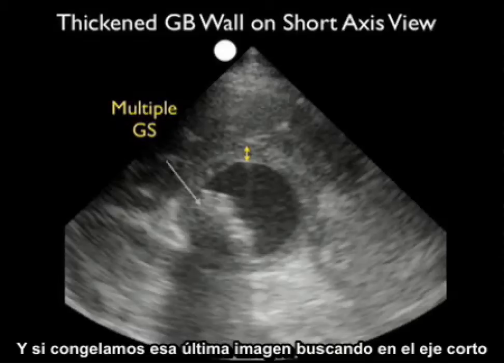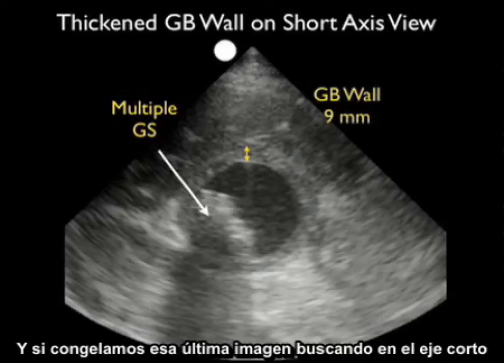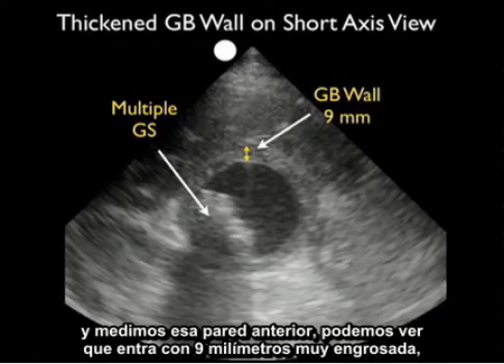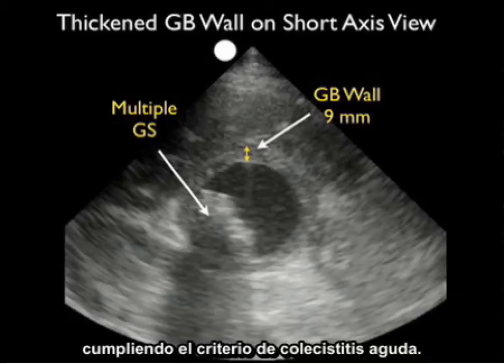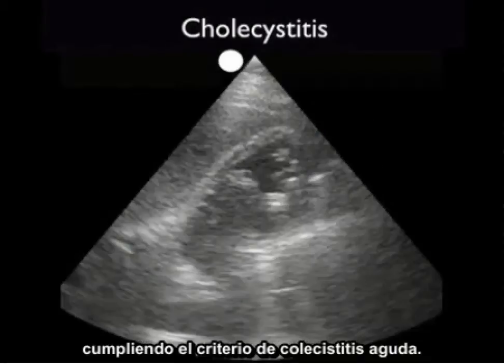And if we still that last image down looking in short axis and measure that anterior wall, we can see that it comes in at 9 millimeters — very thickened — fulfilling the criteria of acute cholecystitis.